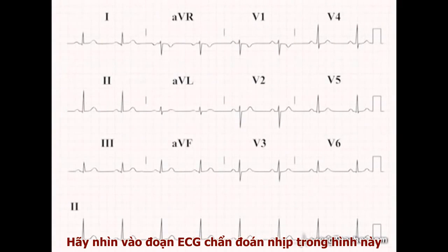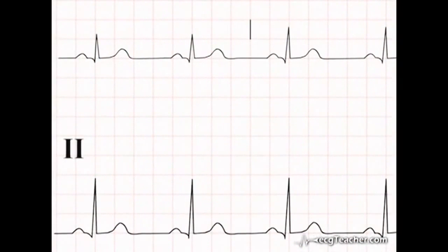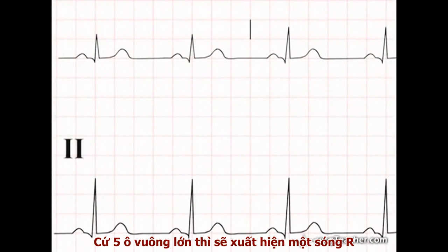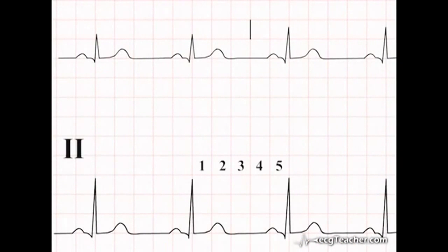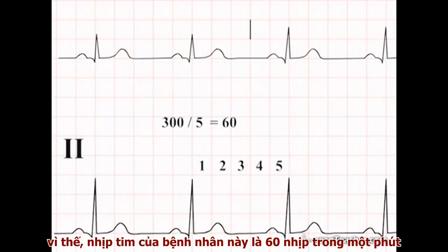Look at the rhythm strip on this ECG. There is one R wave present to every 5 large squares. So in 300 large squares there will be 60 R waves present. This patient's heart rate is therefore 60 beats per minute.